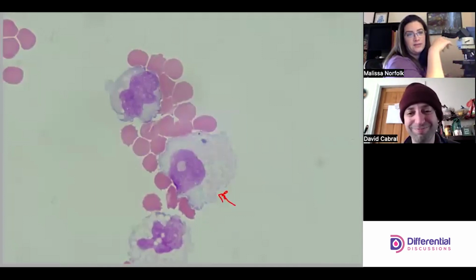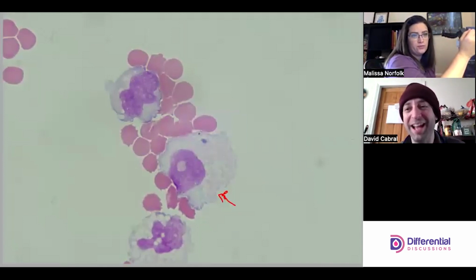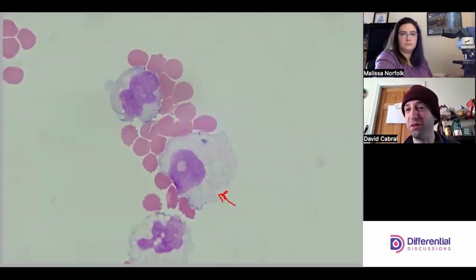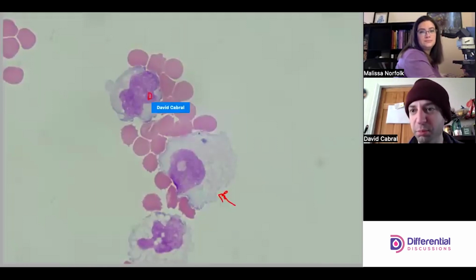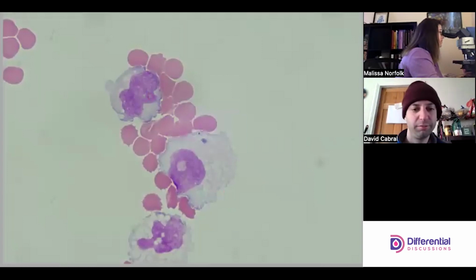Probably not. And even if that's not a ring, say that's a giant nucleoli, that's not normal. Yeah, it's a good point. If someone were to describe that as a nucleoli and you defer and say, fine, I'll accept that, that's just way too big for normal physiology. Agreed. Look, that's a reasonable nucleoli, right? That other one is not too big.